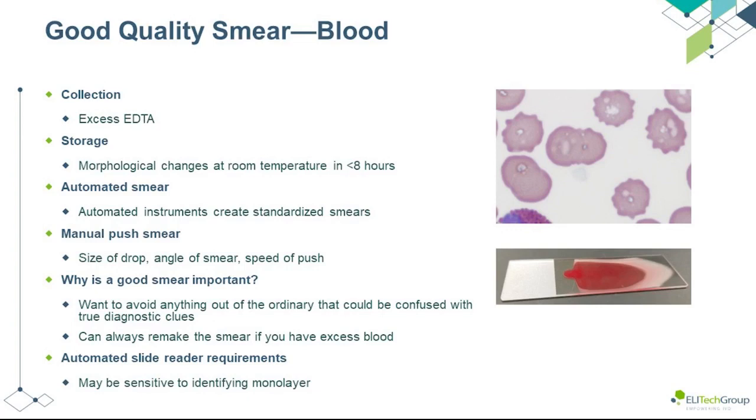Red blood cell crenation is one of the most common artifacts that occurs with storage and sample handling issues. And here to the right is a picture of what those look like. If you work with blood samples under the microscope, this is going to be a familiar image. This type of artifact can be caused by many different things.